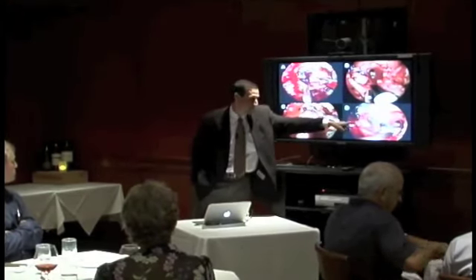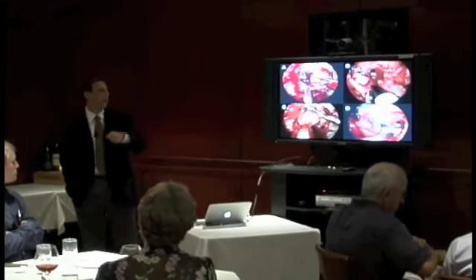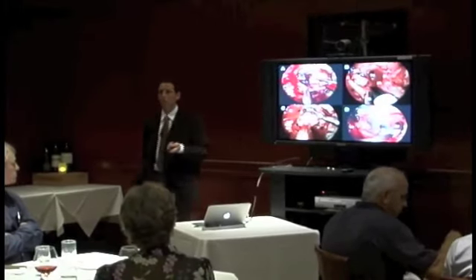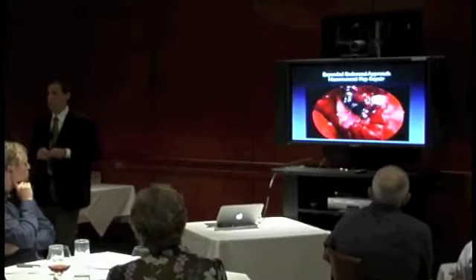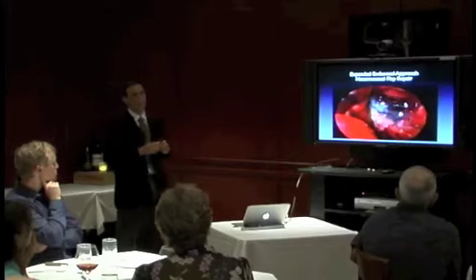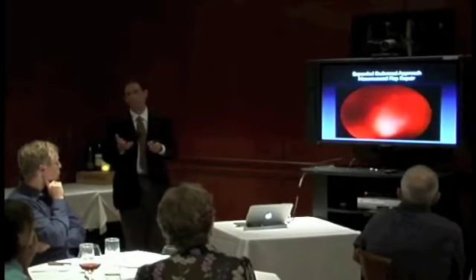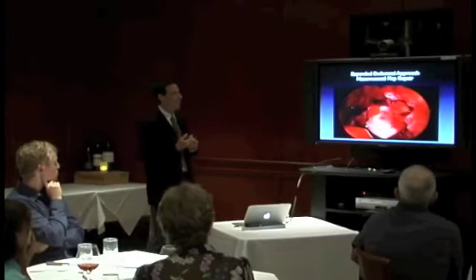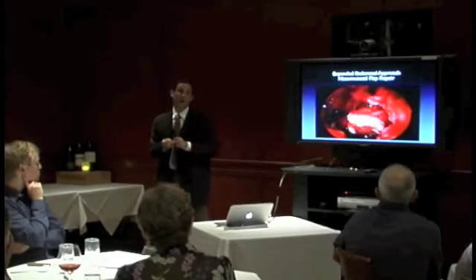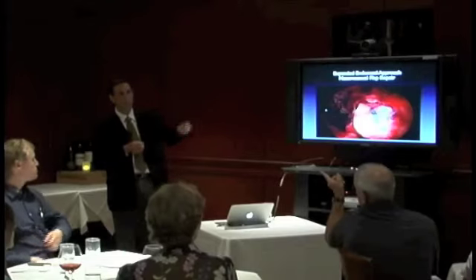And here at the end of the case, you actually can see the carotid artery. This is actually the supraclinoidal carotid artery. It's above the cavernous sinus. You see the optic nerve, you see the third ventricle, you see all the structures, you know there's no more tumor. And this vascularized flap heals fantastic. And it markedly decreases the likelihood of any kind of leakage. You don't need to use alloderm or any of these other foreign materials. And because it's vascularized, it's much more likely to heal and decrease leakage. And so in the very large defects, we will use these vascularized flaps to help minimize the leakage. And so we still pack it afterwards. We still put a nasal balloon in afterwards.